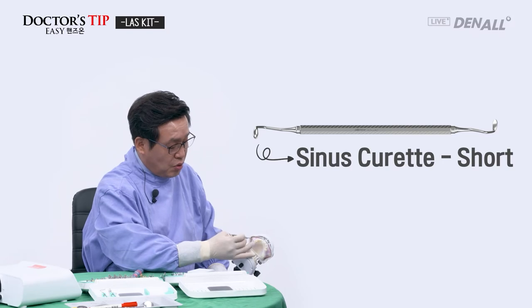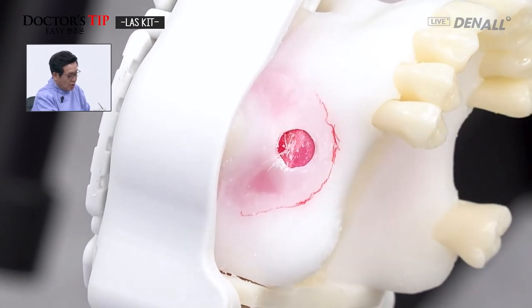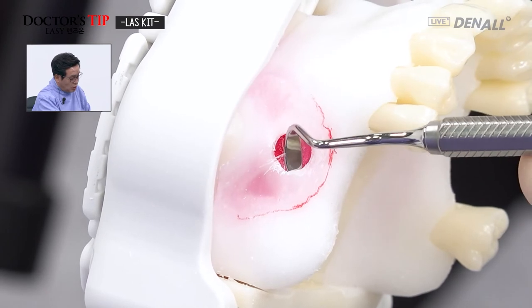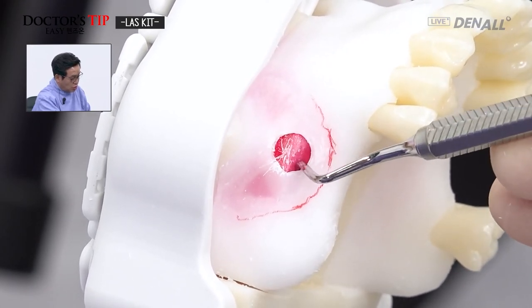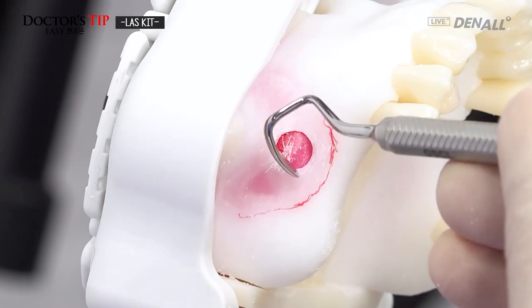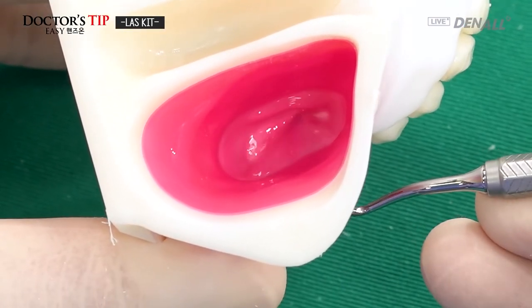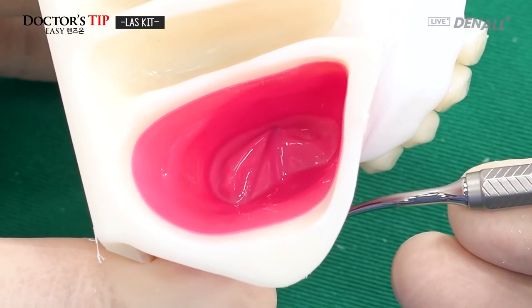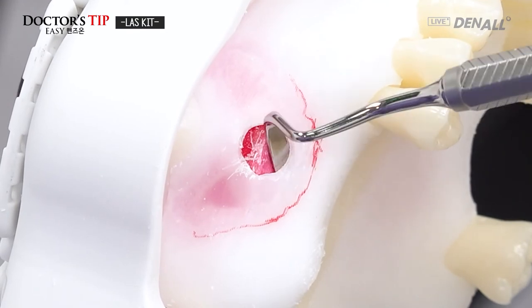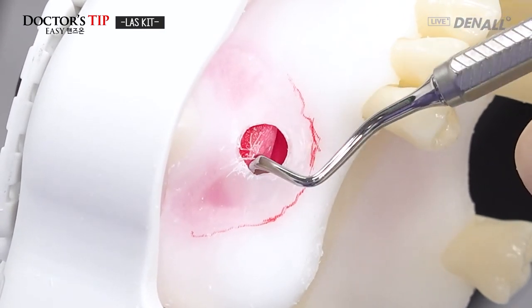And then the sinus curette, the short part, using the short one like this, the sinus membrane can be elevated. And if going a bit deep, it has three curvatures. So on the front part, on the distal side, the upper side, if you access like this, then with the sinus curette, you can access any direction. And using the long part, even on the deep side, on the mesial wall side, you can go in. On the distal, using the opposite side, you can fully access and go in. So if you use the sinus instruments properly, the sinus membrane can be very safely and fully elevated.